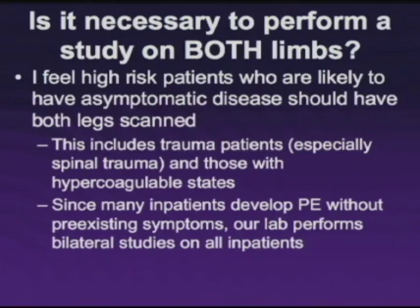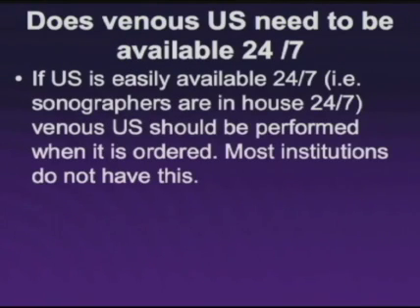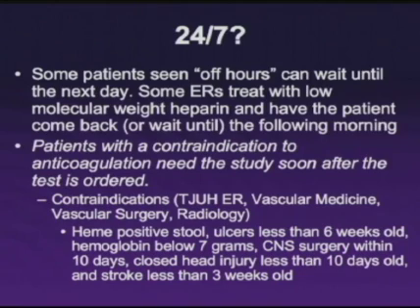The next interesting question is, does venous ultrasound need to be available 24 hours a day, 7 days a week? Of course, if you have ultrasound sonographers or vascular technologists in-house all the time, venous ultrasound should be performed when it's indicated, but many institutions don't have this. And so what can we do? Well, at Jefferson, we don't scan patients 24 hours a day, 7 days a week. There are patients who are seen off hours who wait until the next day.